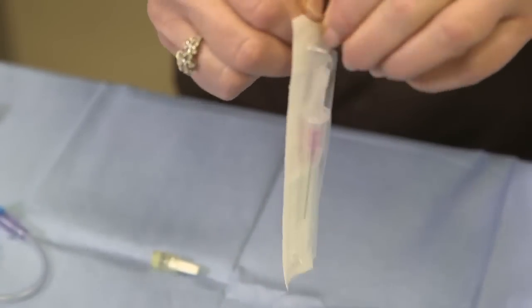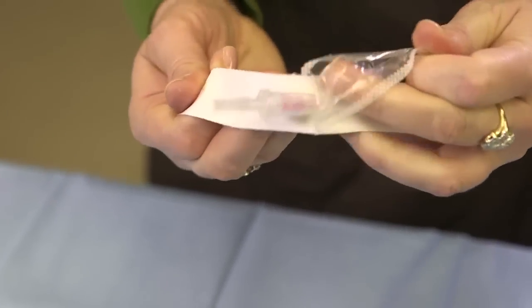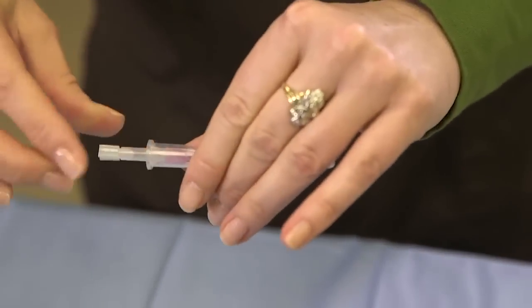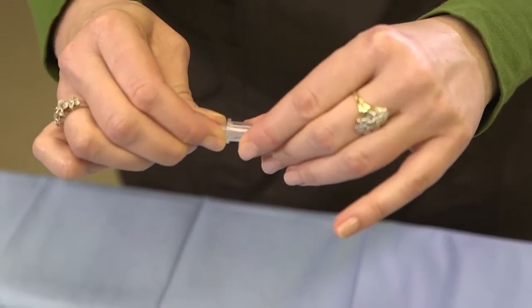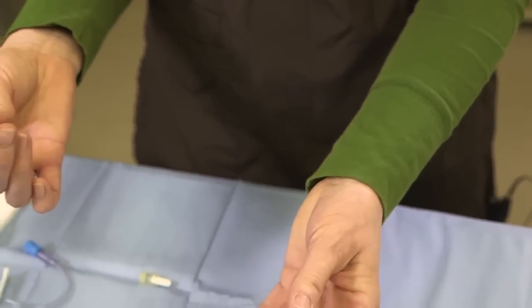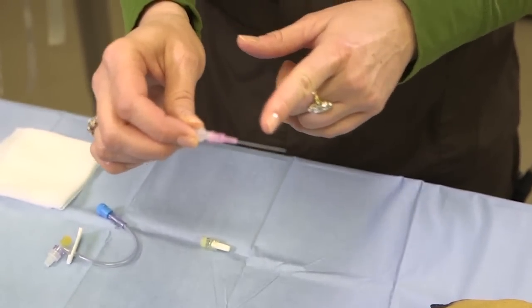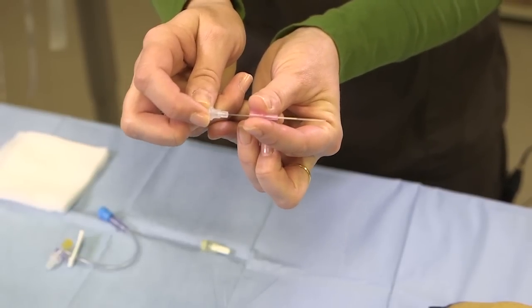Everything inside this package is sterile, so you want to be mindful of what you're touching and where. When you pull this off you can get rid of your casing. This part right here is the catheter — this is what slides off the stylet.